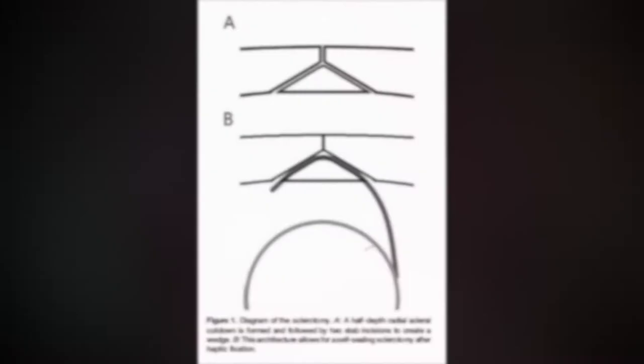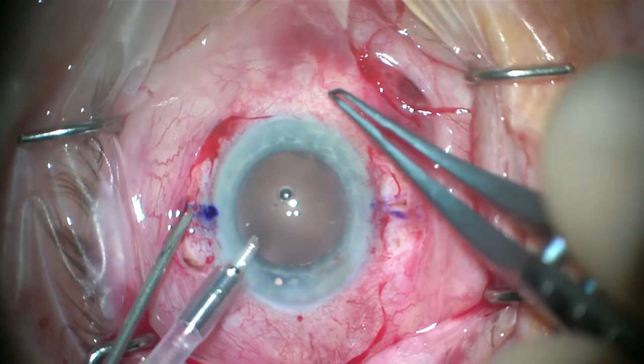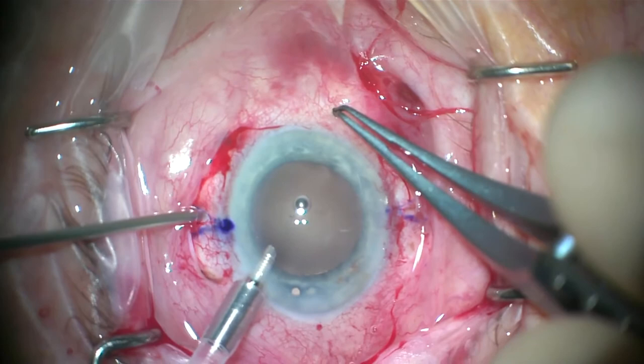This is a cross-sectional diagram of the self-sealing sclerotomy wounds. The half-depth radial scleral cut down is formed, followed by two stab incisions to create a wedge. Here you see it in action: following the radial cut down, the micro vitreoretinal blade is used to create the stab incisions inferior and superior to the radial cut down.